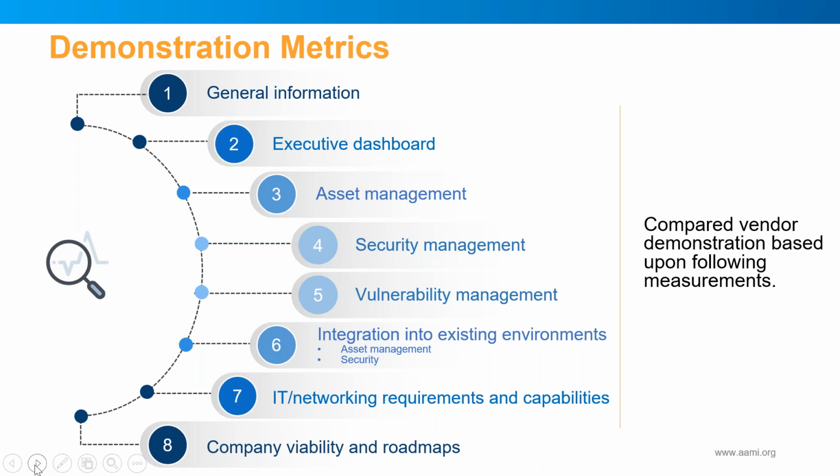So yeah, our key item on this screen is that when we first started this path, we didn't realize how big of a journey it was going to be for us. We thought it would be just a quick make a selection and go on with it. We learned really quickly that we didn't have all the stakeholders at the table. So for any hospital that's going to go down this path and is looking to implement this type of technology in your organization, I urge your clinical engineering and healthcare technology management departments to work quickly with your information security departments and your networking team.